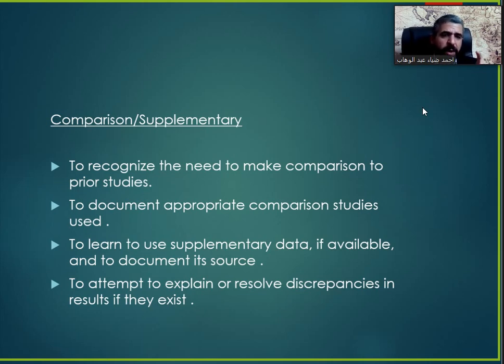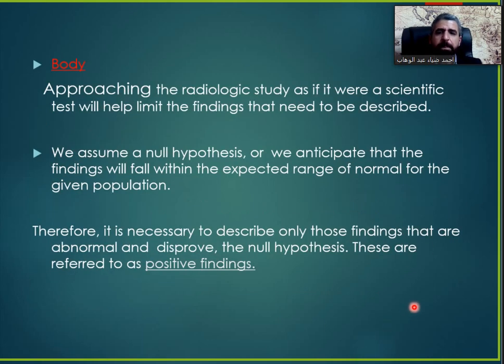Now to one of the most important parts of the report, that is the body of the report. The body of the report approaches the radiological study as if it were a scientific test and will help limit the findings that need to be described. We treat the radiologic study as if it were a test in the lab, the same thing.